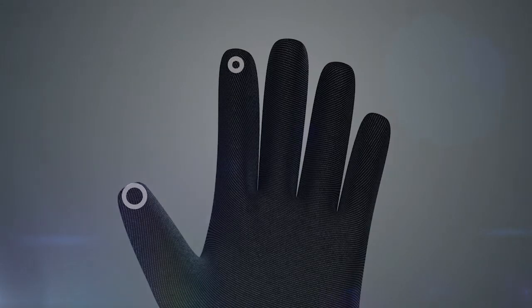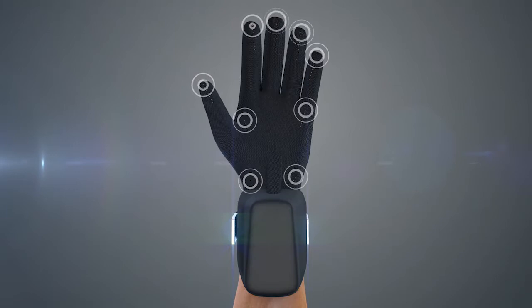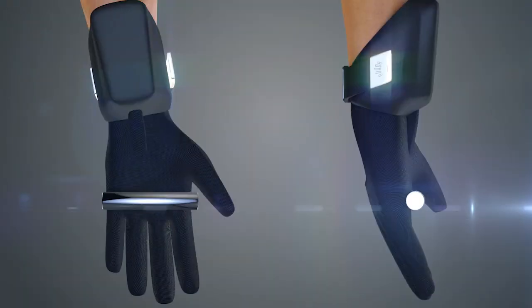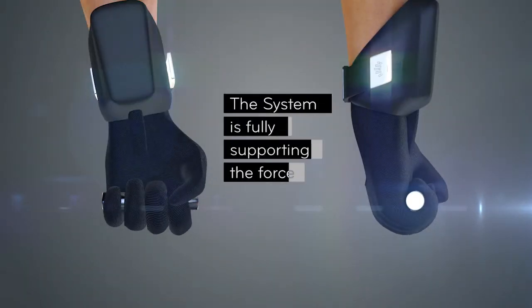With special sensor combinations developed by Nuwada, the system detects when the user is closing their hand. The force generating components in the bracelet, recognizing the need to support the user's movement, force the artificial tendons to adapt. When the hand is closed around the object, the system is fully supporting the force generated on the fingers in hand.